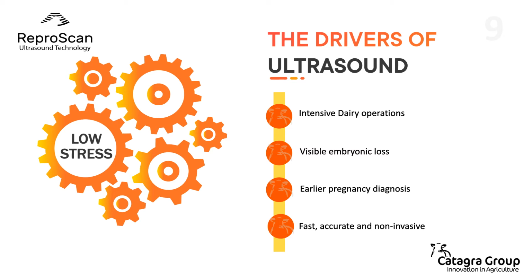Ultrasound offered an alternative of an accurate, early, fast, and non-invasive method of preg testing. It also allowed pregnancies to be aged into 5-day intervals for improved drying off and calving management. Along with this, it enabled signs of disease to also be detected, such as uterine infections, cysts, mummified calves, and fetal demise.